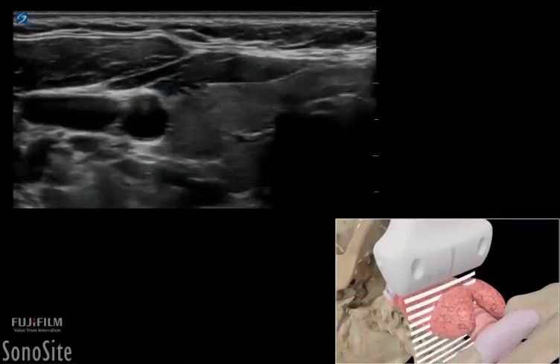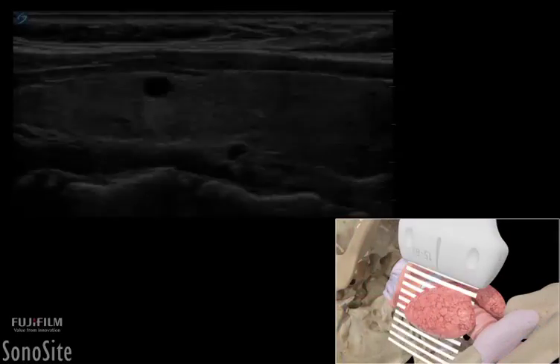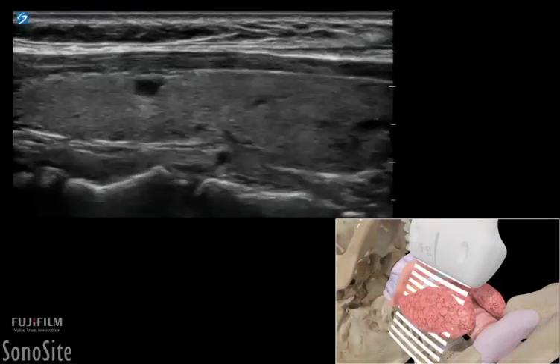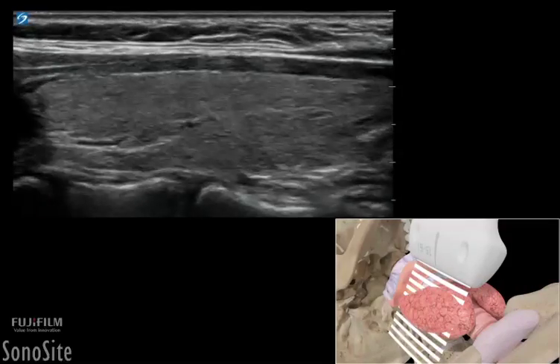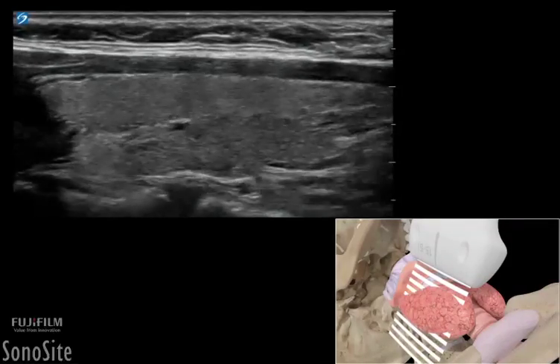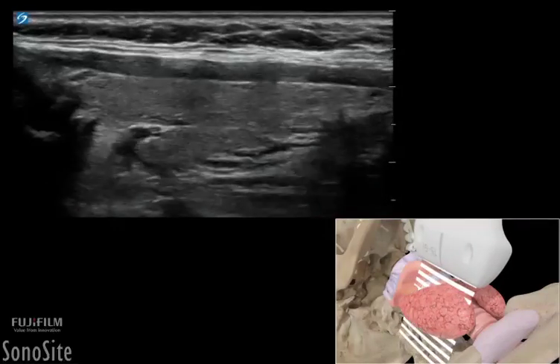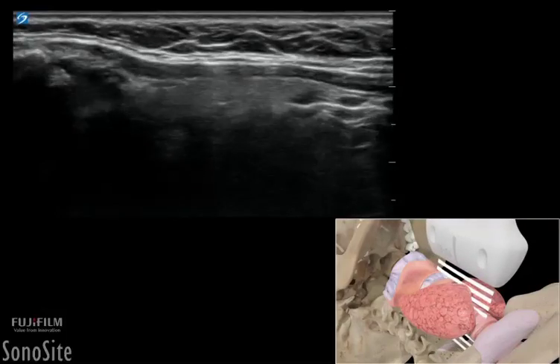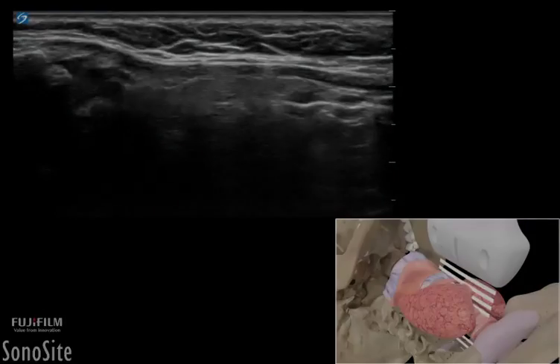The transducer is then rotated 90 degrees with the orientation marker directed to the patient's head to scan both sides of the entire gland and isthmus from a lateral to medial position.